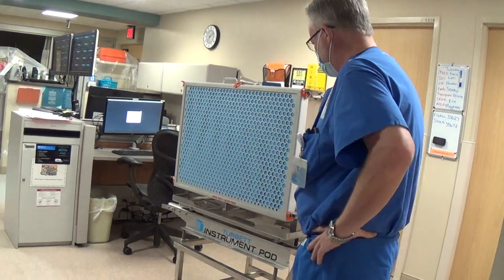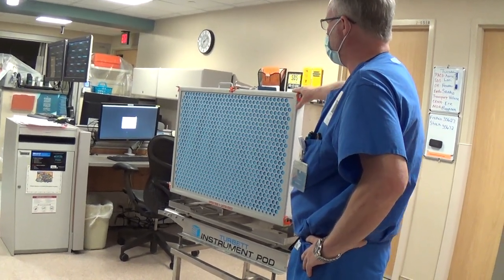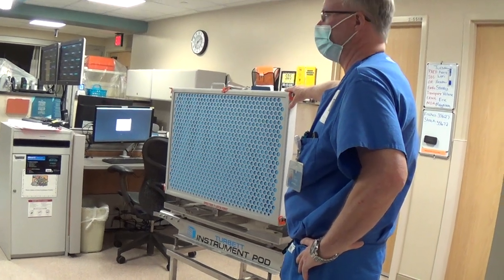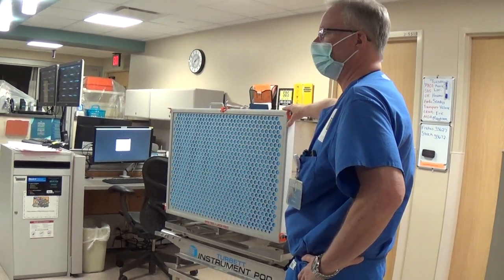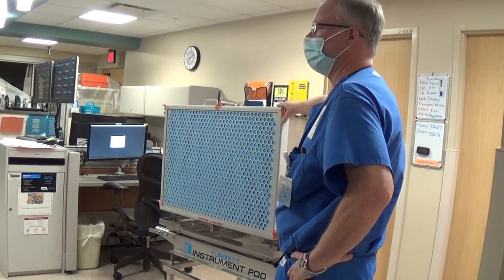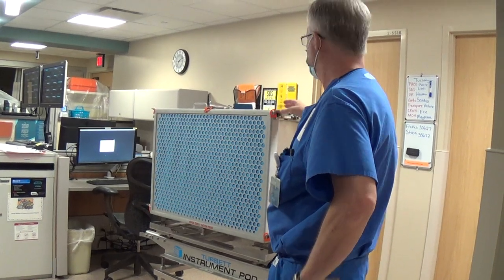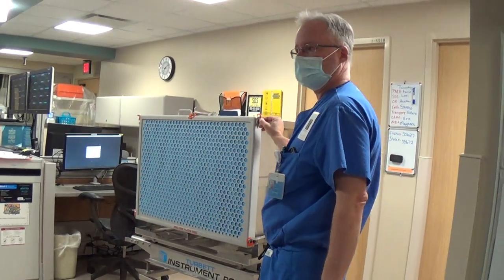Basically, you can now put instrumentation in this module — up to 15 trays — sterilize it without wrapping any of the trays, bring it into the room, open it, and take everything out. So you want to go through and just pop through it?